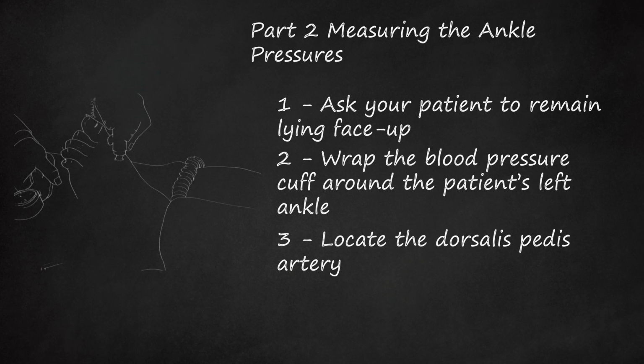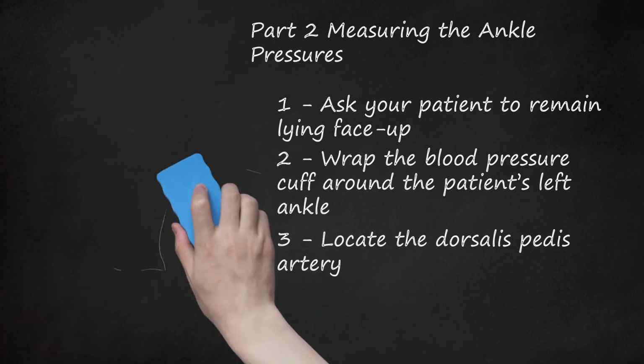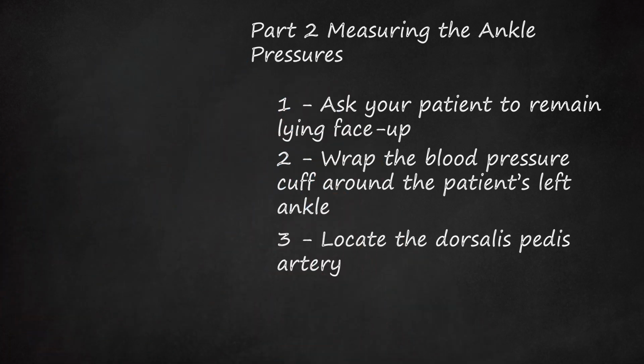The dorsalis pedis, DP, artery is located on the upper surface of the foot, right near where the foot meets the ankle. Spread ultrasound gel on this upper area of the foot. Use a Doppler probe to locate the strongest point of the DP. Move the probe around until you find the spot where the pulse is the loudest. You should hear a pulsating or whooshing sound.